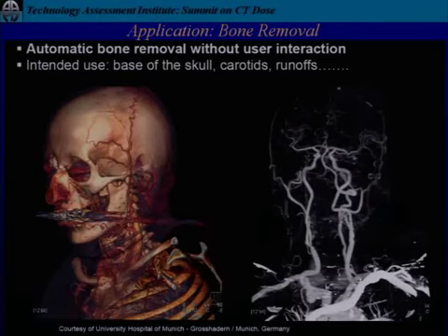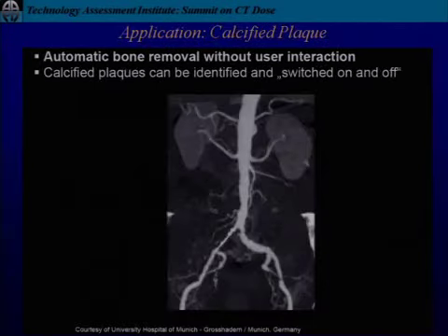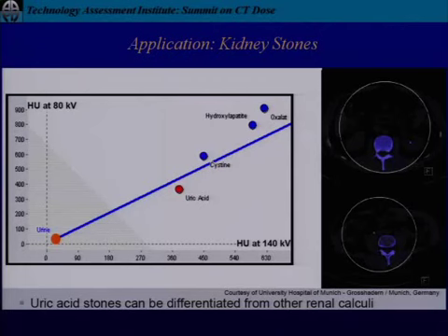Okay, and if you have dual energy, irrespective of what is the underlying engineering of the device, the physics doesn't change. So you can do pretty much the same sort of things no matter which scanner you're using. For example, you can do bone subtraction here, and you can see, for example, the iodinated contrast within the vessels. You can take out all the calcified plaque from the aorta, and you can have this essentially non-calcified portion of the aorta. You can do plaque analysis.